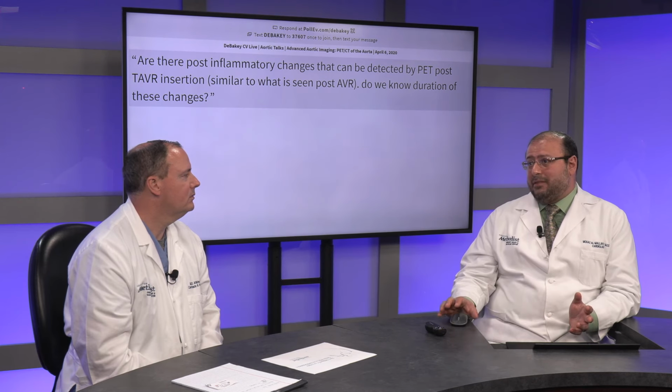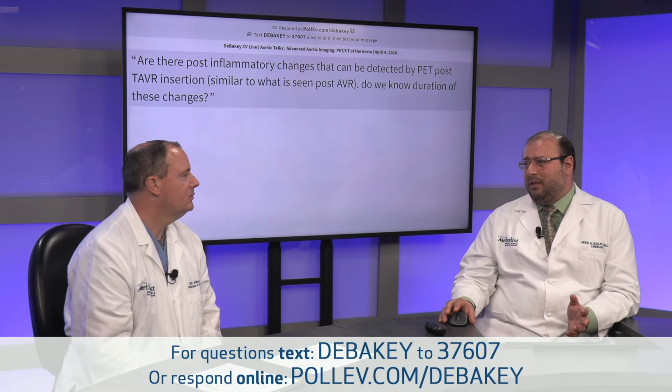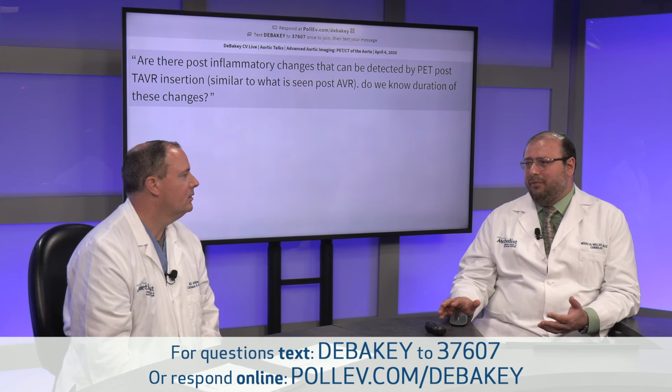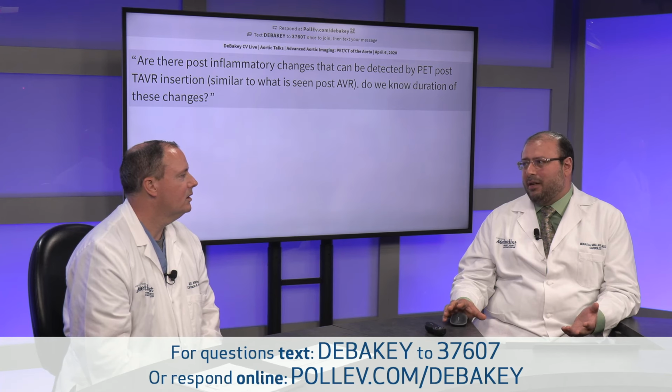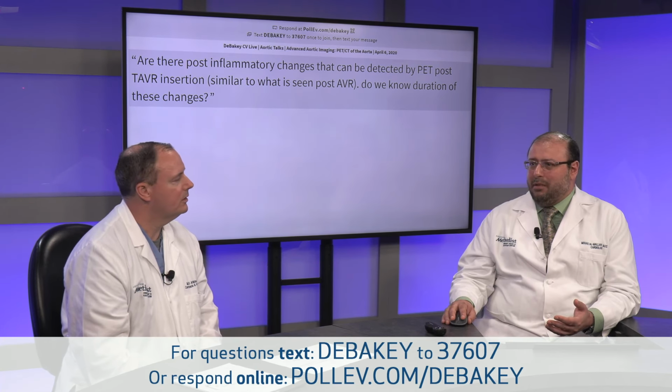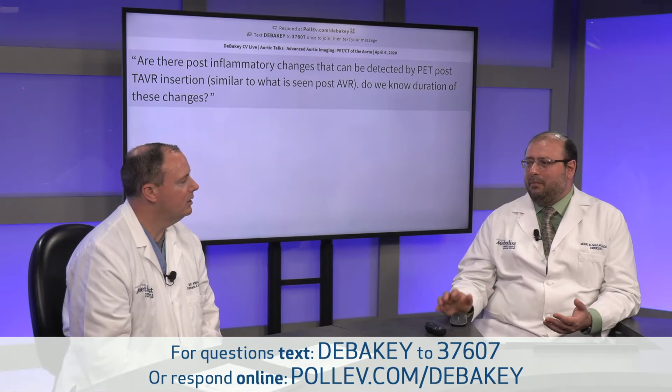For example, in PET, we do have some challenges with patients with diabetes who are on high insulin requirement and insulin resistance. If I know, at least personally, that the patient uses very high basal insulin, we may run the risk of being unable to get good images, and I would recommend that we start with MRI and complement it. Gotcha. But I think most of the time these two techniques are complementary and comparable in terms of accuracy.